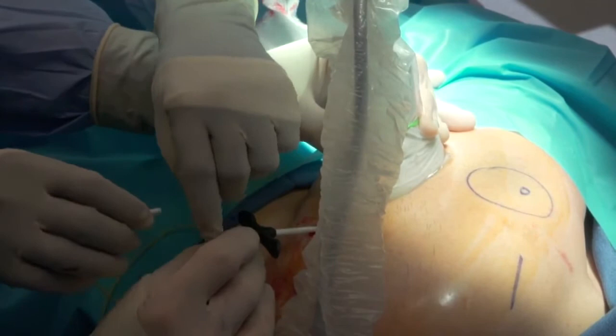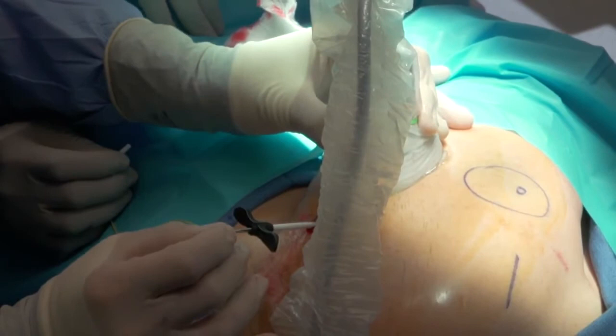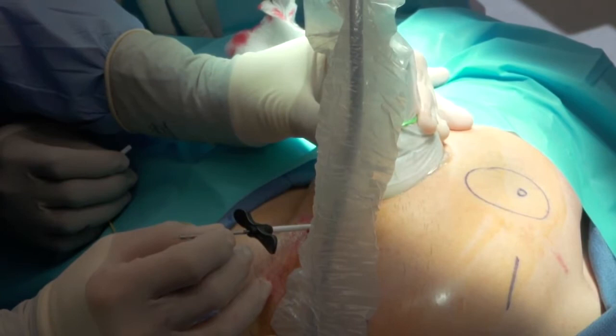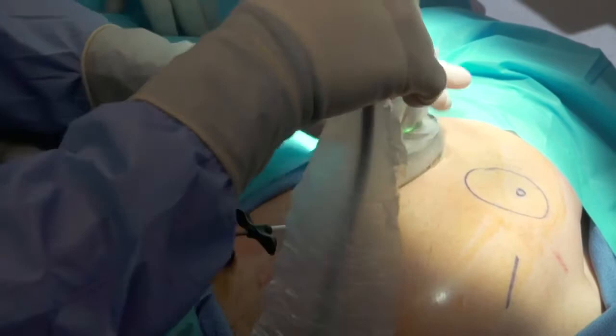And then what I'm going to do at this point is pull the... So how far in are you? Because if you've gone past the black... okay, no, you have not deployed the anchor yet. So you want to put it back so you're black on black. Okay? And then you want to start to hold that lead loader and retract the sheath, so the lead loader doesn't move as you're pulling the sheath back. Good. That will deploy the anchor.